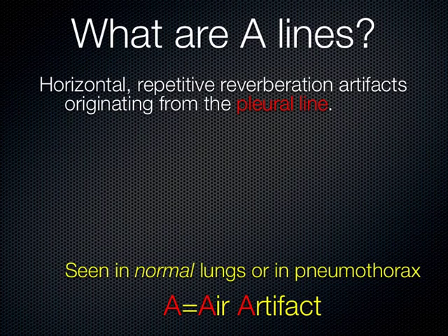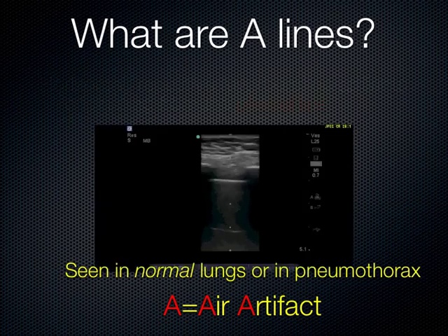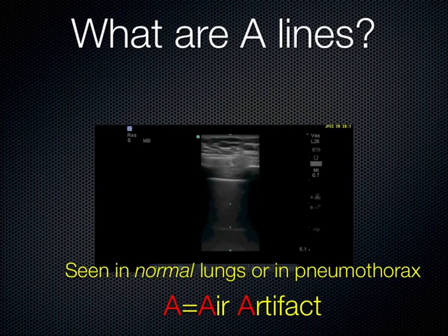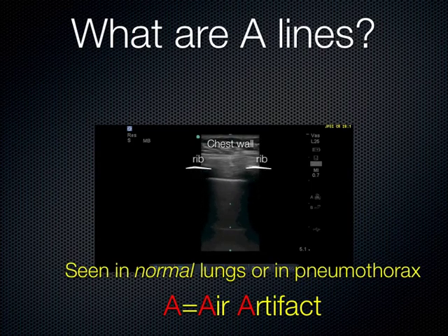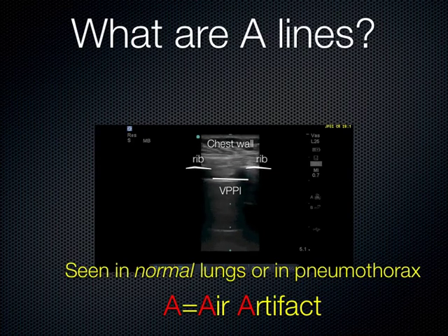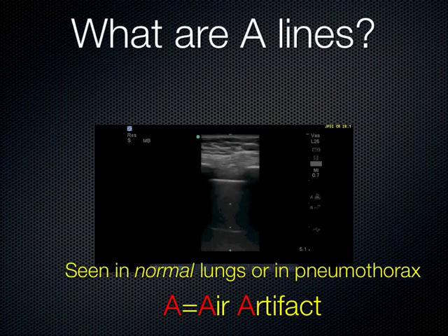You can see A lines in normal lungs or in pneumothorax, because A just means air — it doesn't tell you where the air is. The air could be in the lung in a normal situation, or it can be outside the lung in a pneumothorax. Here you can see the chest wall, the ribs with bright white cortex, the pleural line about a half centimeter below the ribs, and then down here the A line — a reflection of the pleural line deeper. That's artifact; it's not really there. The ultrasound waves get trapped in that bright white pleural line and reverberate back and forth.